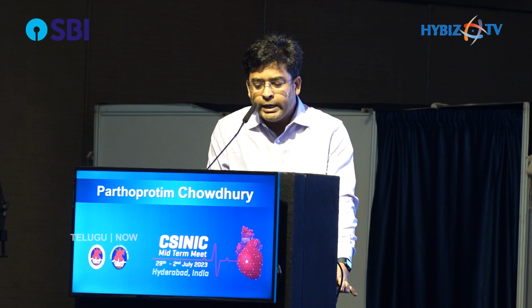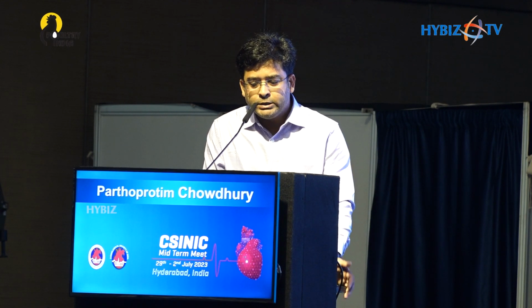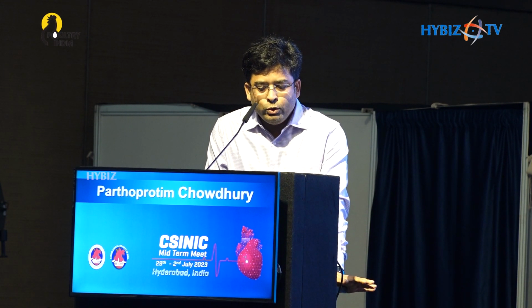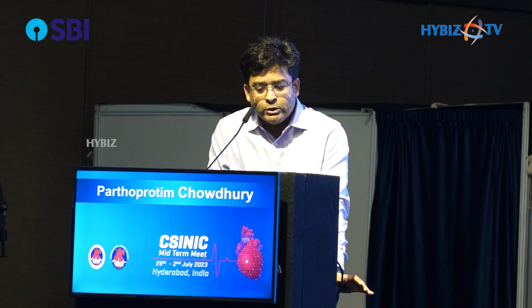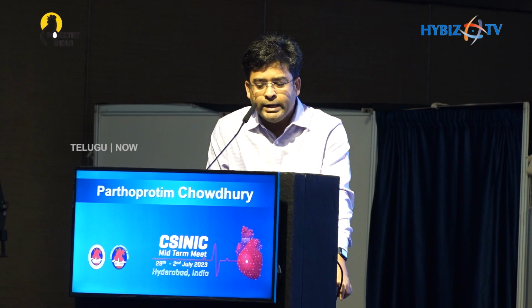And if you have a specialty guide cath, it's very well. If you don't have one, then also we have an option. We can modify the simple guide cath that we have in our lab. So this is the inverted Judkins method. You take a slightly undersized 6 French 3 through 3.5, loop the 0.035 wire upward in the left sinus, and follow with the guide cath with a clockwise twist. The catheter inverts and points anteriorly and will hook into the anomalous RCA.